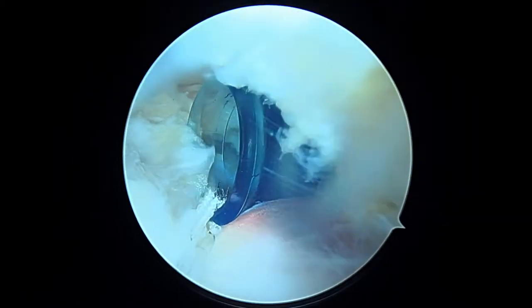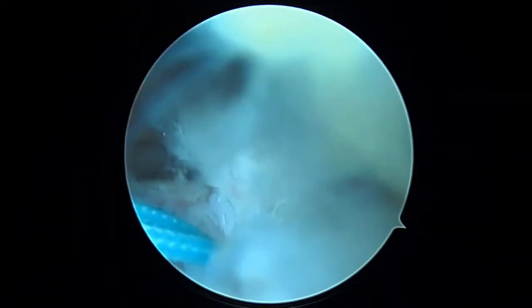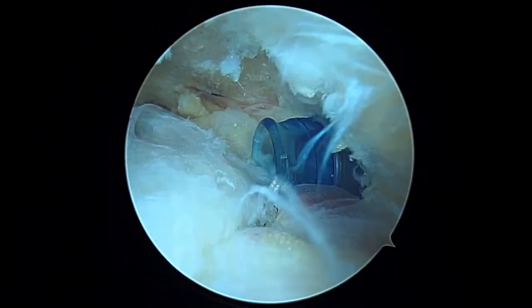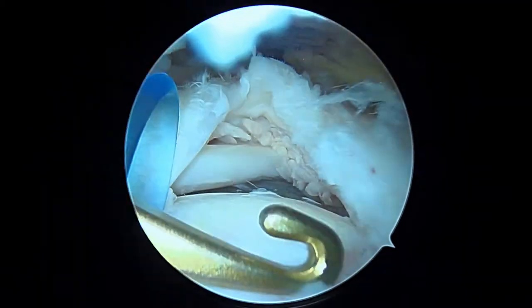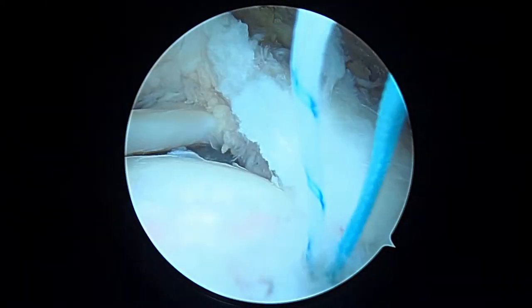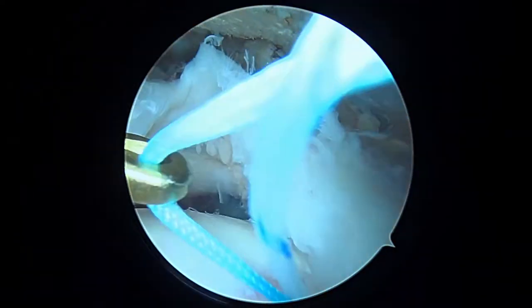We've tied that first knot — there's the cut end of it right there. You can see that's giving us a really good posterior anchor point. I'm happy with that. Now we're going to keep working with the remaining two sutures here — I think I'll take that solid blue one next.